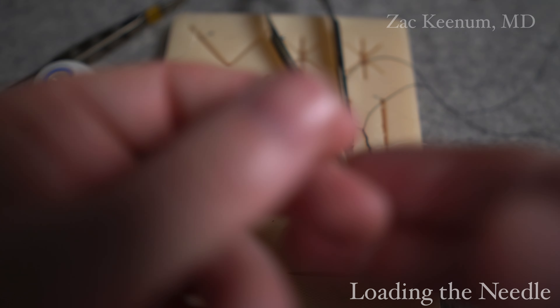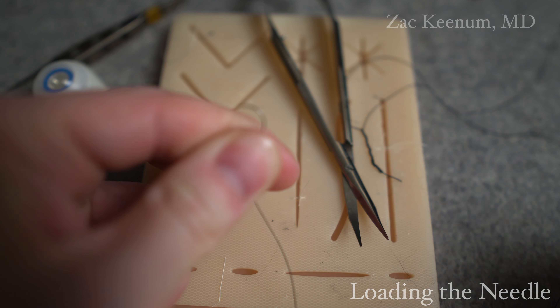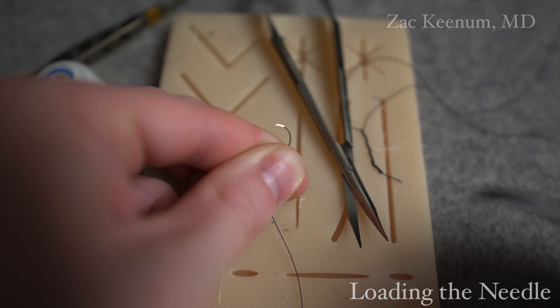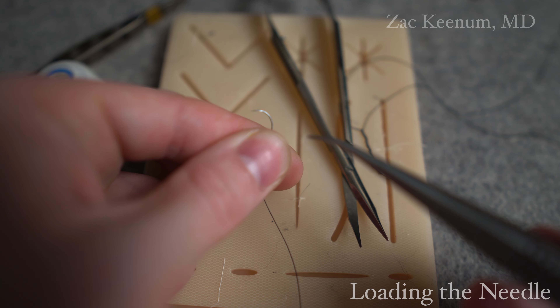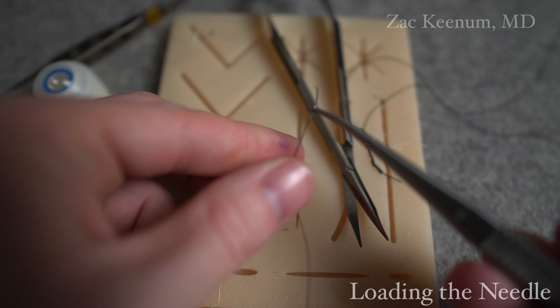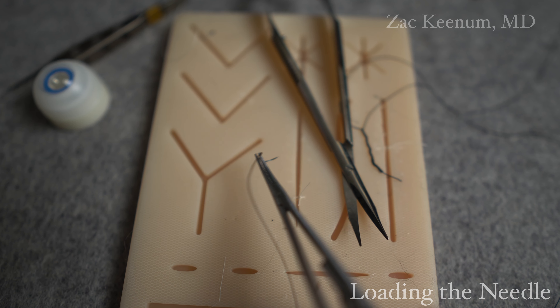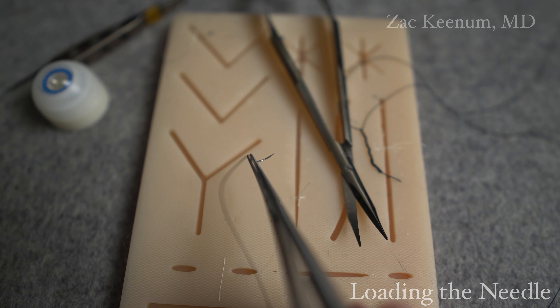If I want to backhand, I do the same thing. I grab my dominant hand, slide through my non-dominant hand. I have control of the needle without actually grabbing the needle. So funny ducks by underwear - BU, backhand up, face the needle up. I then load it in the same way. I'm ready to backhand it - backhand meaning pass it this way, back of my hand this way.